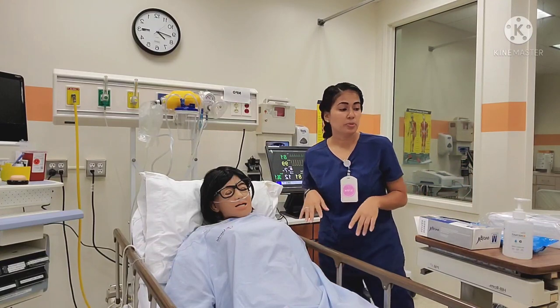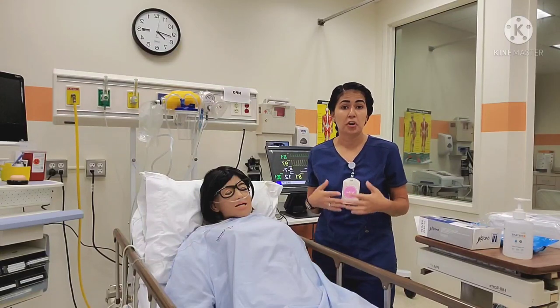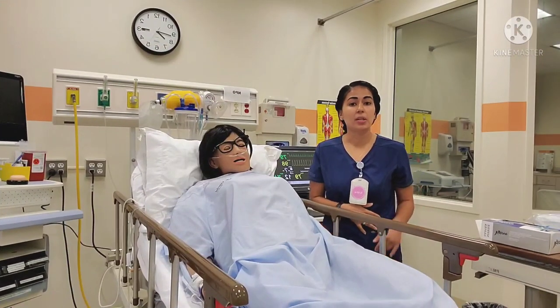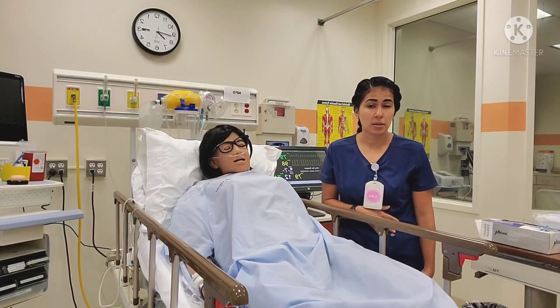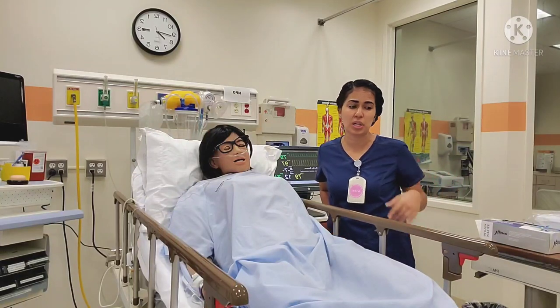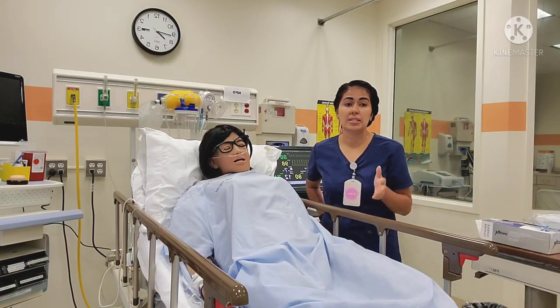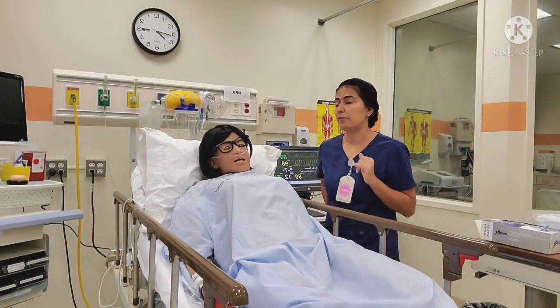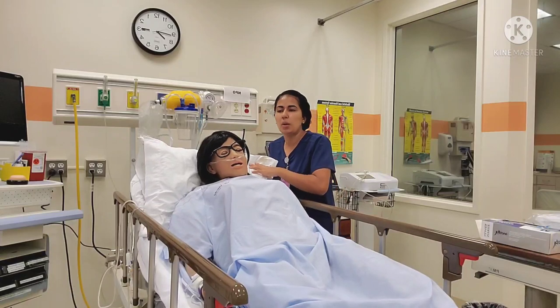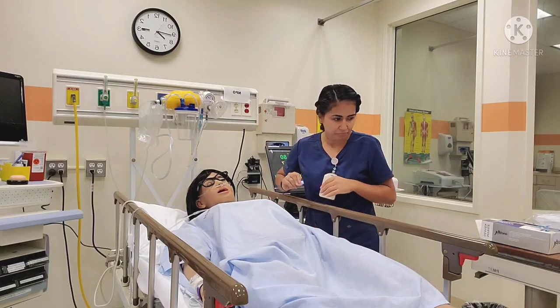We've explained the procedure and gathered our supplies. Now we want to put the patient in the optimal position to insert the catheter. I'm going to elevate the bed to between my mid-thigh and waist area so I'm not leaning over and hurting my back. Miss Hill needs to be lying flat — that's going to make it a lot easier to insert the catheter. If you have any trouble breathing or feel any discomfort at any point, please let me know.